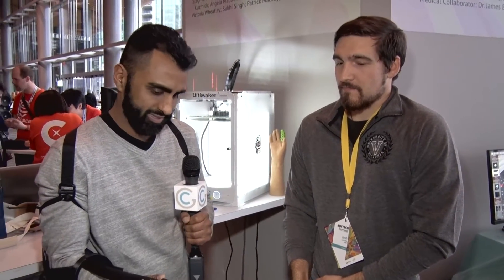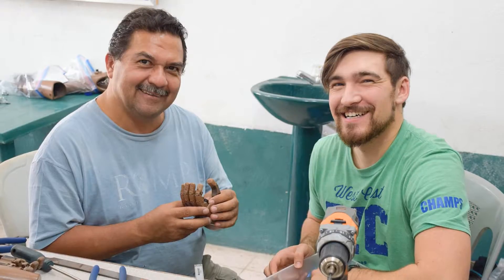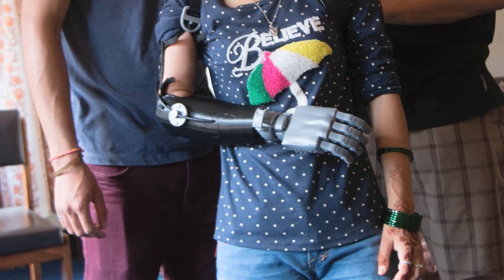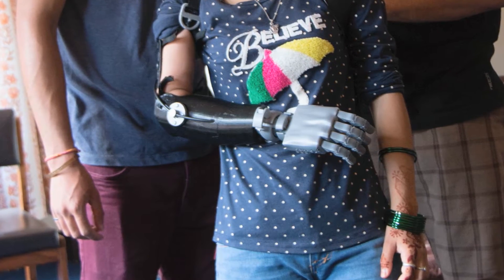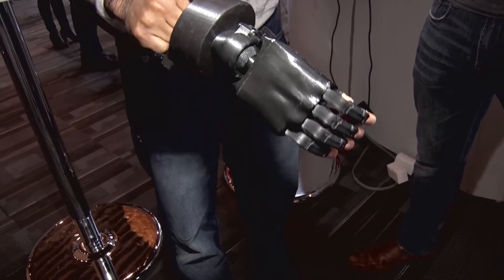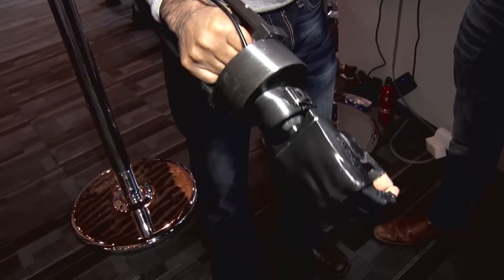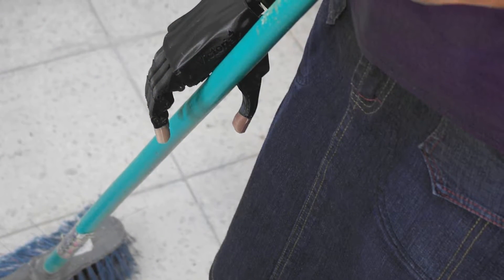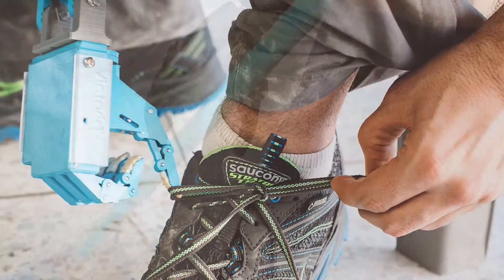So who is this really based for? Who would it help out? Because of the low-cost nature, we're aiming for developing countries, and in particular women and children. The hand itself is actually quite a small device, and because it's made of plastic, we're looking at things like cooking, using it in the office, using it for washing, or just going around town.